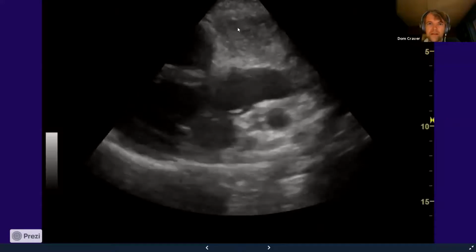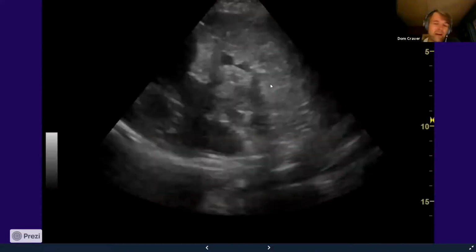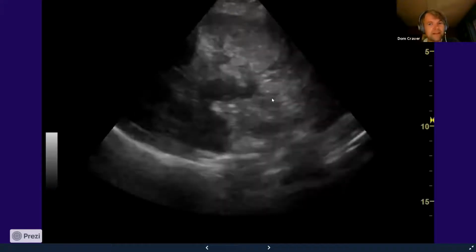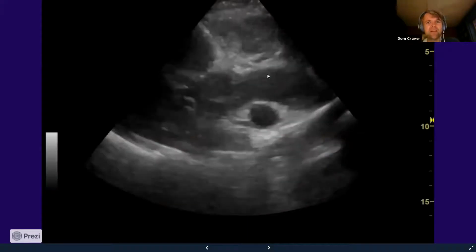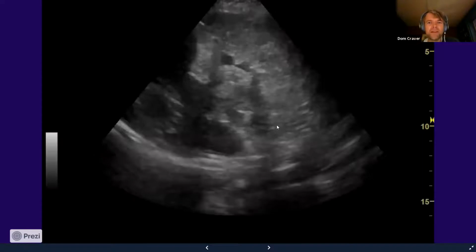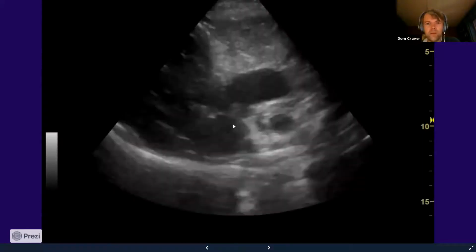You don't normally see this because you've got all this tissue-like mass surrounding the aorta there. I didn't really know what it was. I assumed it was probably lymph nodes, but this is getting way beyond my expertise at this point. But I knew this kid was sick. He's got this mass-like structure in his right hemithorax, and it's all surrounding his aorta. You don't normally see the structure here. So what do we do?